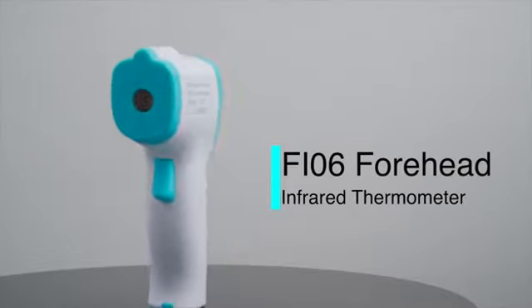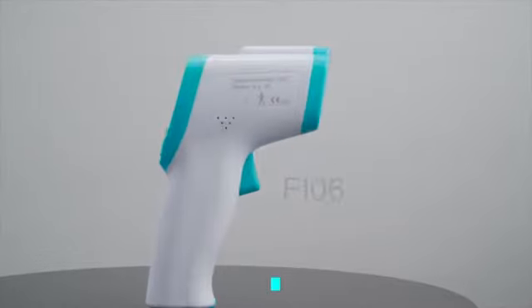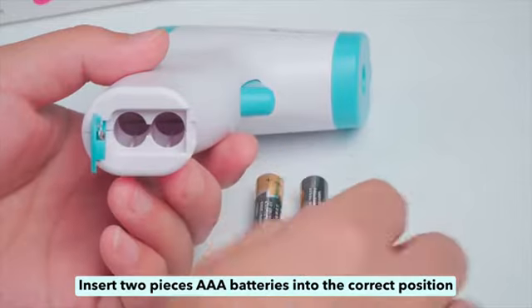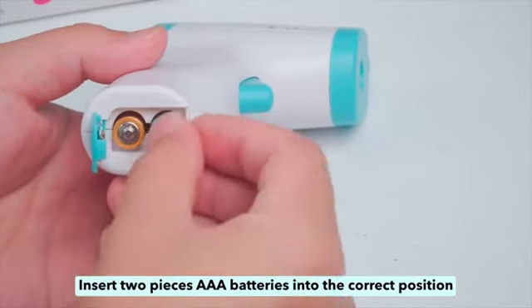FI-06 Forehead Infrared Thermometer. Insert two AAA batteries into the correct position.